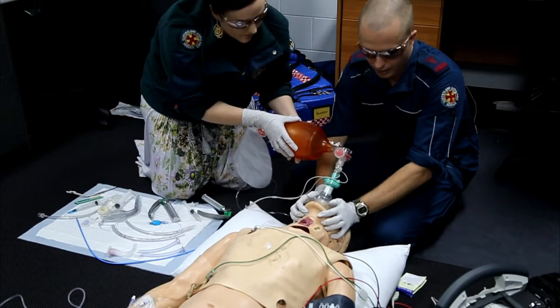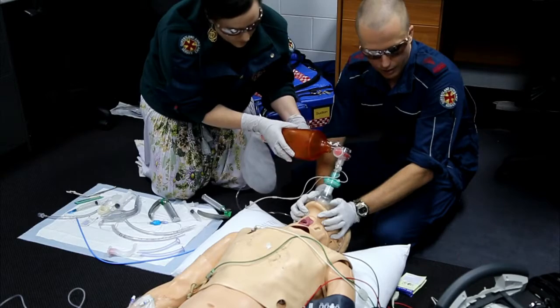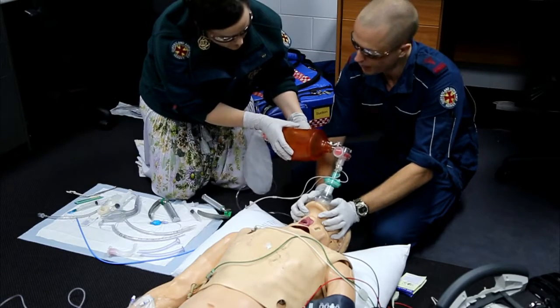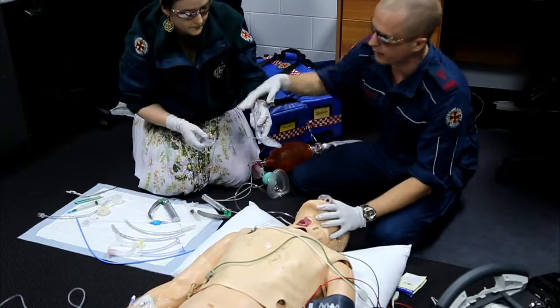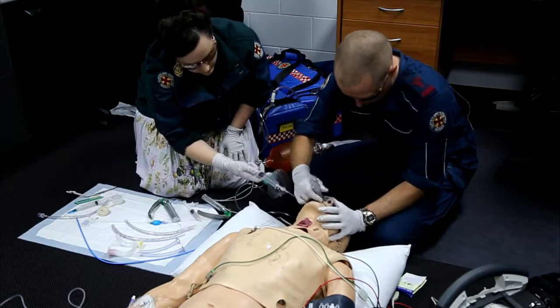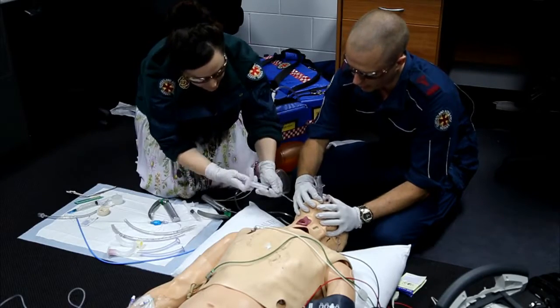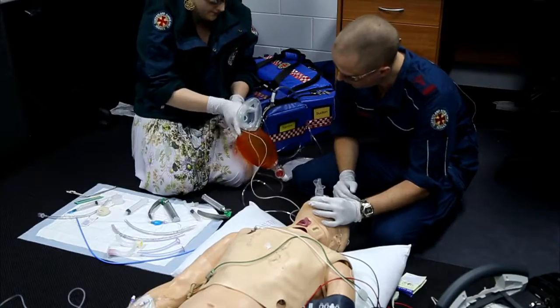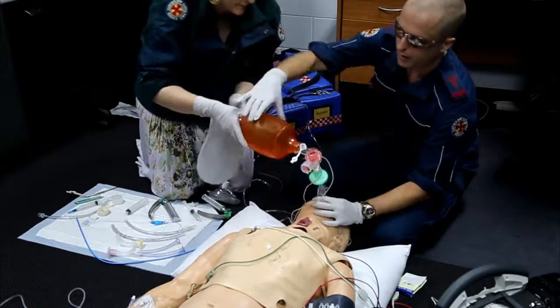Okay, so again, got no rise and fall of the chest and no capnography waveform, so we're going to have to proceed straight to an LMA. Okay, so let's pull it off. Alright, thank you. Inflate the cuff. Thank you. Inflated. That's grand.